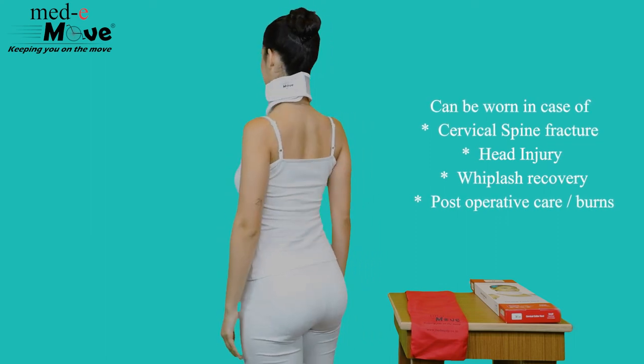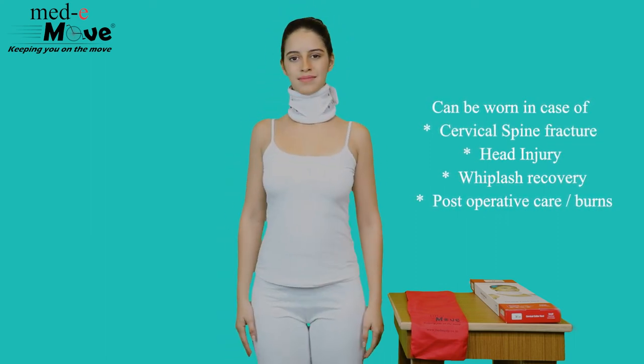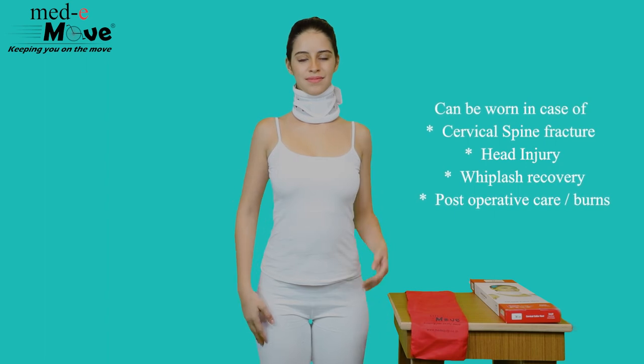The Medimove Cervical Collar Heart can be worn in case of cervical spine fracture, head injury, whiplash recovery and post-operative care, and burns.